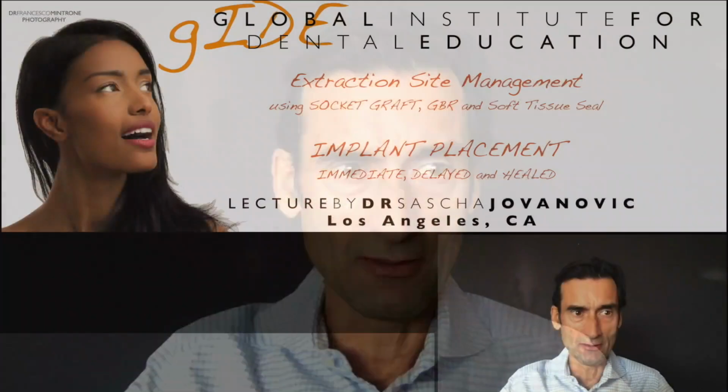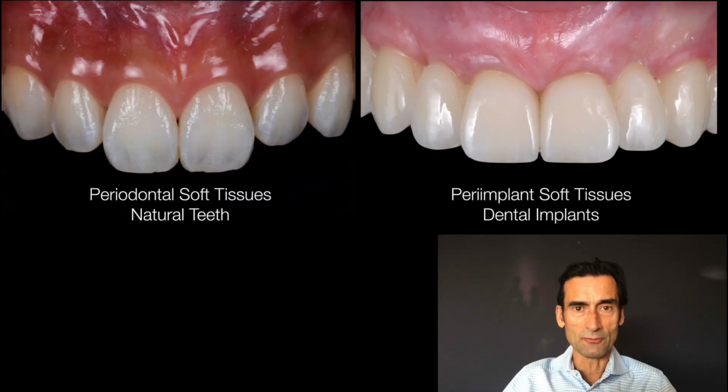So first of all, extraction site management. We can use socket grafts. We can use GBR grafts. We can use soft tissue grafts. And of course, we can use a combination of all. Implant placement can be done at different time points. It can be done immediately at the time of socket preservation or at the time of extraction. It can be done delayed, and it can be done in a healed site when all the tissues have stabilized. So let's look and see what we do.